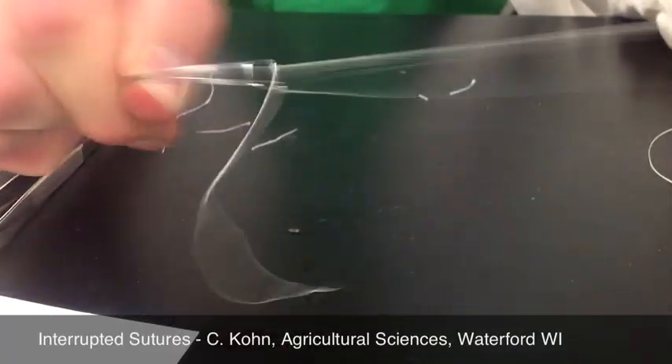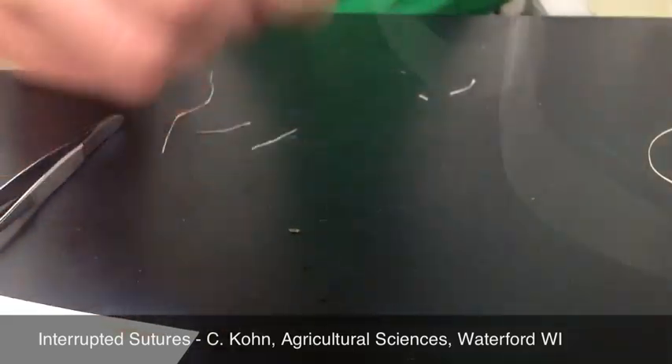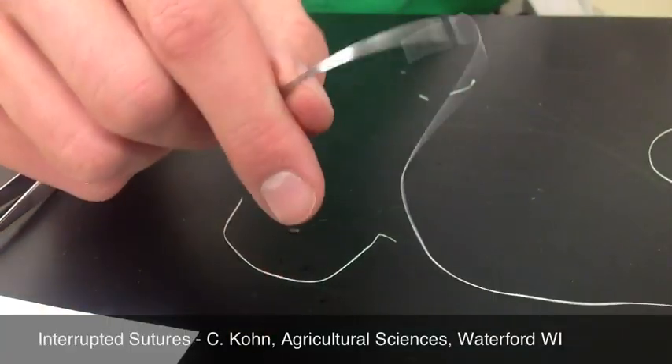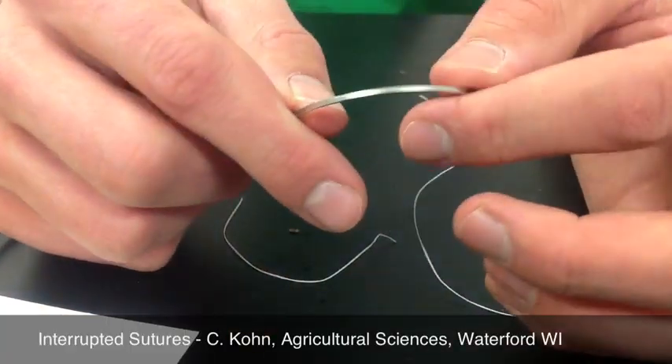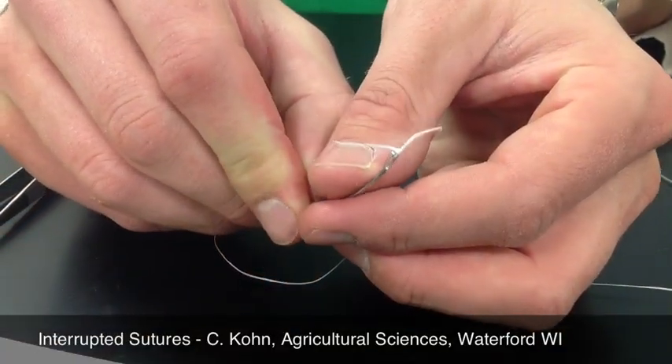If I did a granny knot, when I pull on this, it should pull the other end through — which it's not. So I have it right. As long as it doesn't come untied, that's the key. I'm going to snip off my tail so it's relatively short. I don't want it all the way down to the knot because then it might pull out, but I do want it to have about a half an inch for a tail.